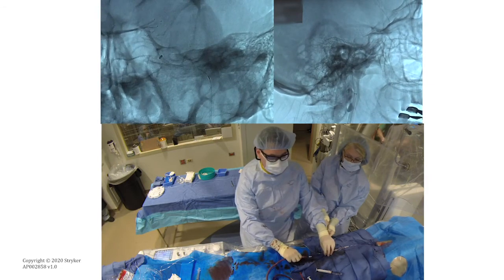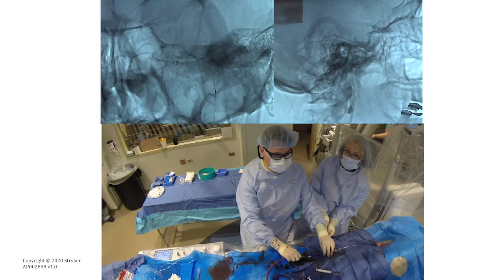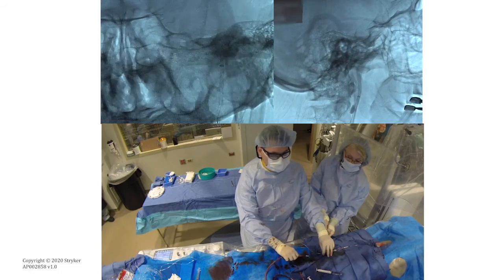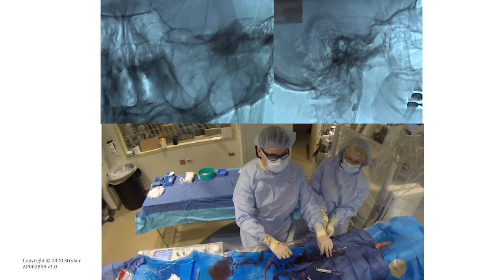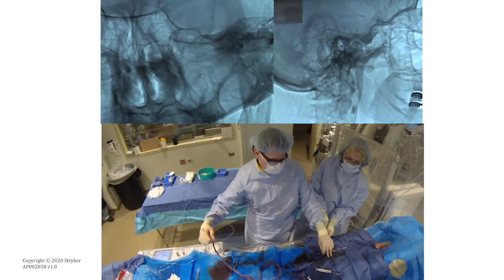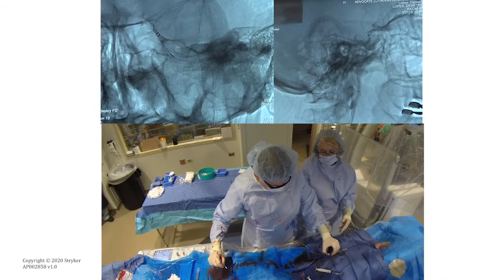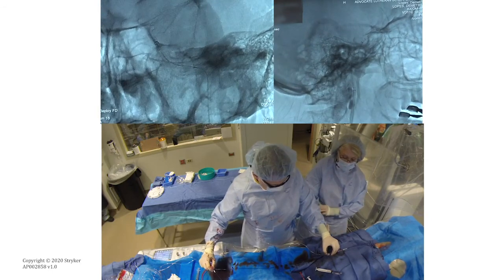And then now you see the two hands, how you gently pull the system together. And here I think you feel you have total control of the situation, because you have your balloon guide in position, not allowing any distal embolization, and you have the clot trapped between the Cat 7 and the Trevo stent retriever. Now a very important step here is that we open the rotating hemostatic valve so that the Trevo can pass through it without flaking off any clots.